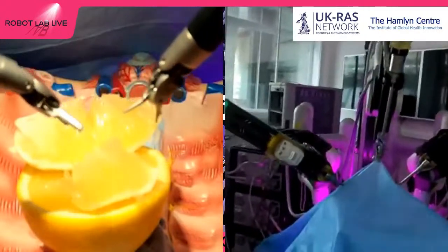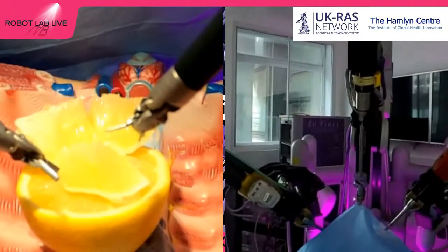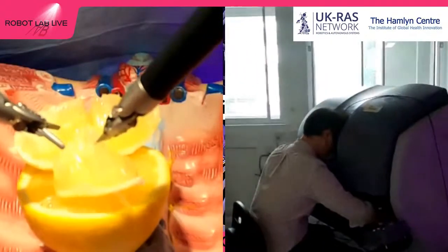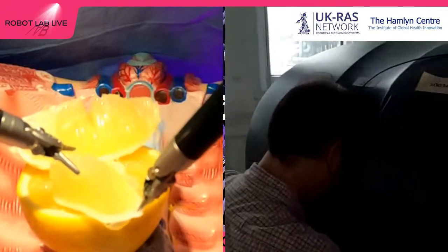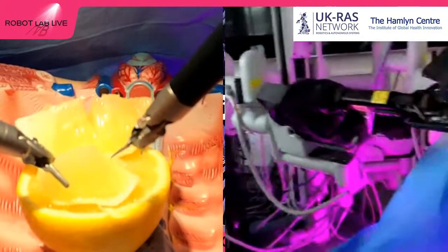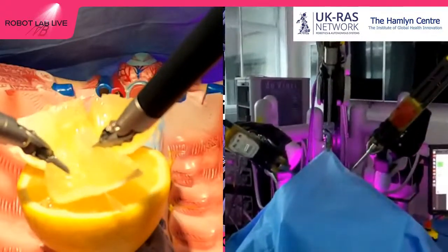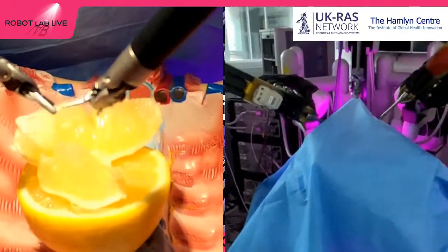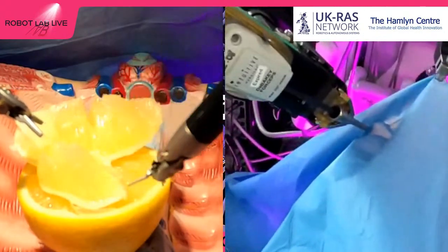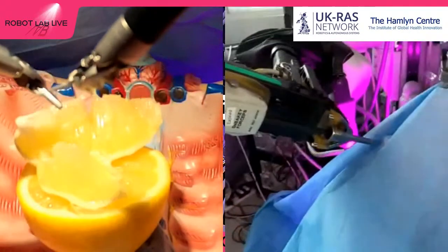And you may be asking, how is he able to see what's going on inside? That's why we use the third arm in the middle. It's a stereoscopic camera that provides Sen a 3D vision of what's going on inside. So as you can see, he can observe everything that's going on inside our patient. If you think about it, it's as if the surgeon were inside the patient with his eyes and his hands, with only three tiny scars, as you can see right now.